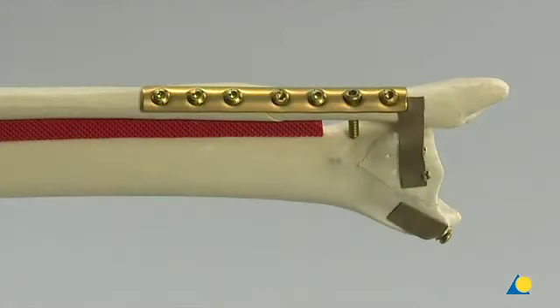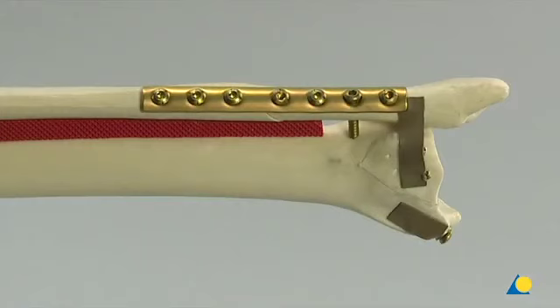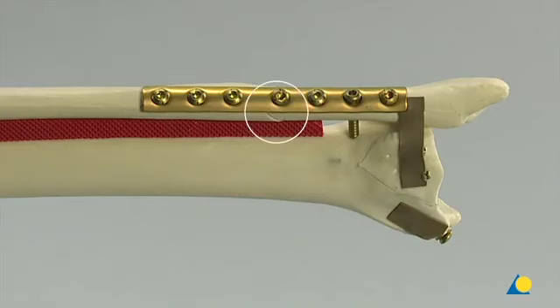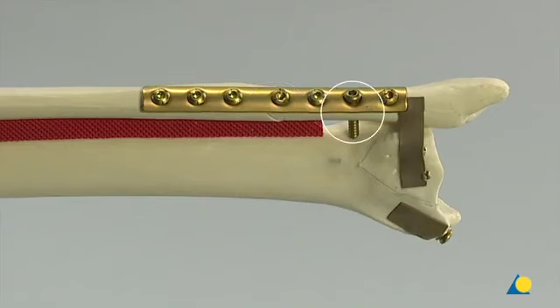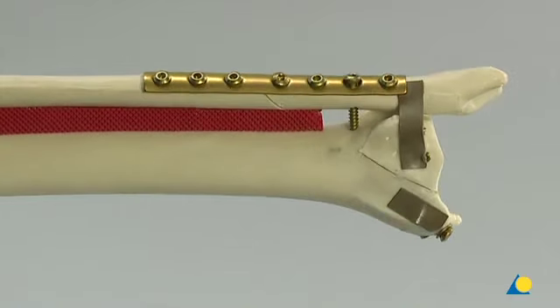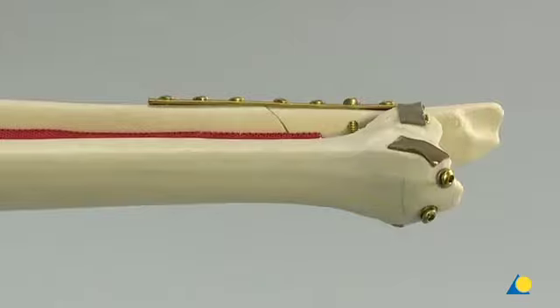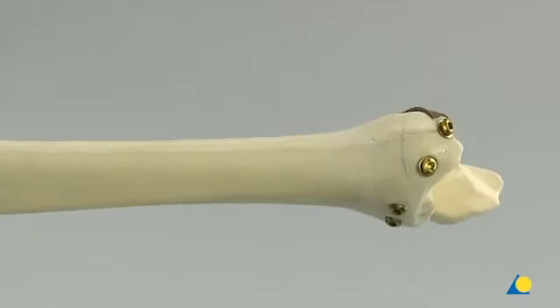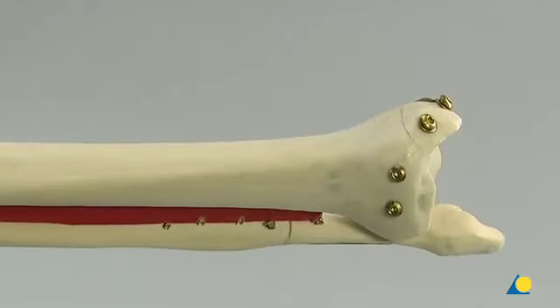The internal fixation is performed with a 7-hole LCP 1/3rd tubular plate using a lag screw through the plate. A position screw is used to secure the syndesmotic ligaments. In addition, a lag screw is used to fix the medial maleolus and a screw fixation of the posterior maleolar fragment from anterior is performed.